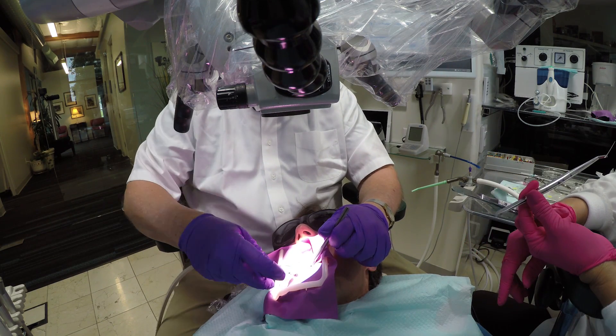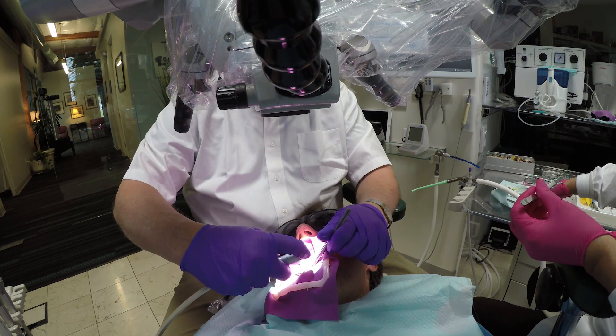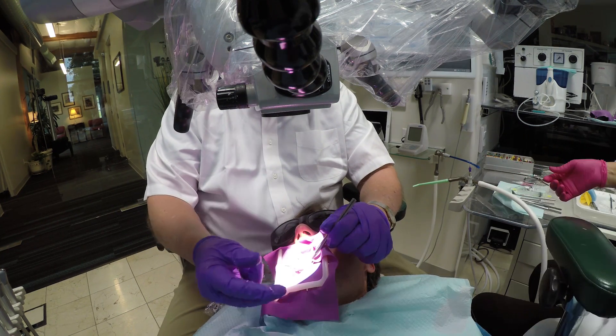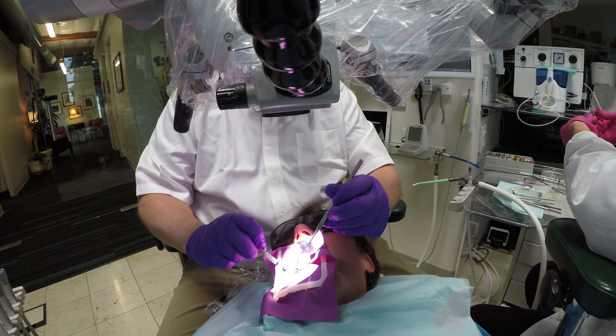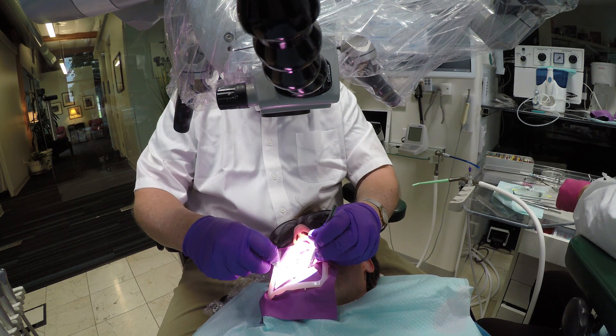And all Joy has done during this whole procedure is just use her large suction. This whole visit took about 12 or 13 minutes from start to finish, including numbing the gum up. So that's how we're doing it in our office.